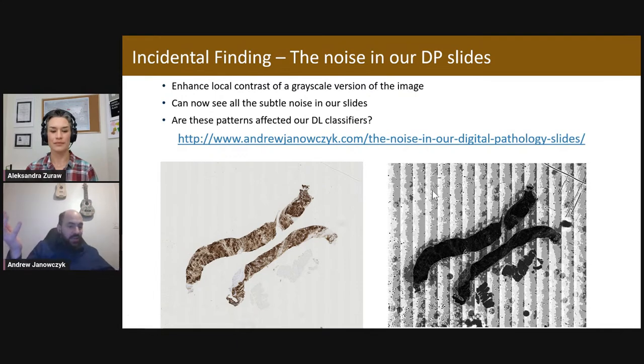I think it's just pretty cool to look at, and you could certainly see that some sites are able to put out better quality slides than others. You can also start to see the age of slides by certain different patterns that appear there. I think it's a fascinating discovery that we made completely by accident.